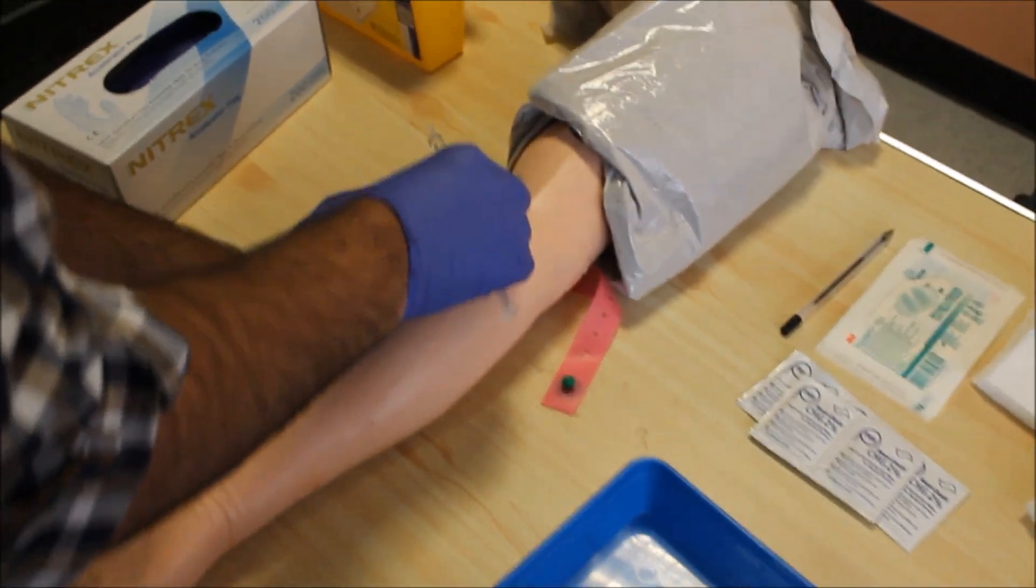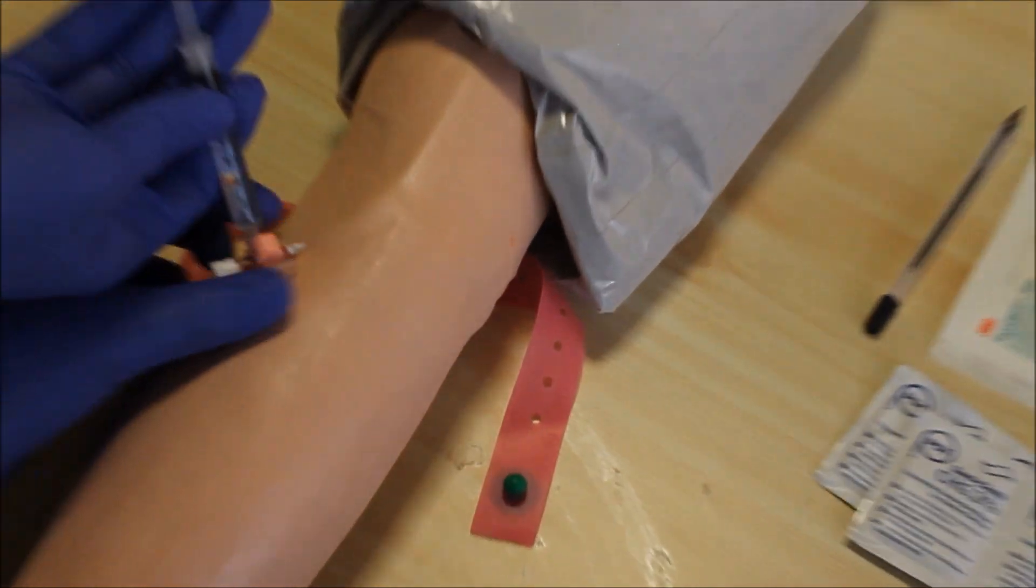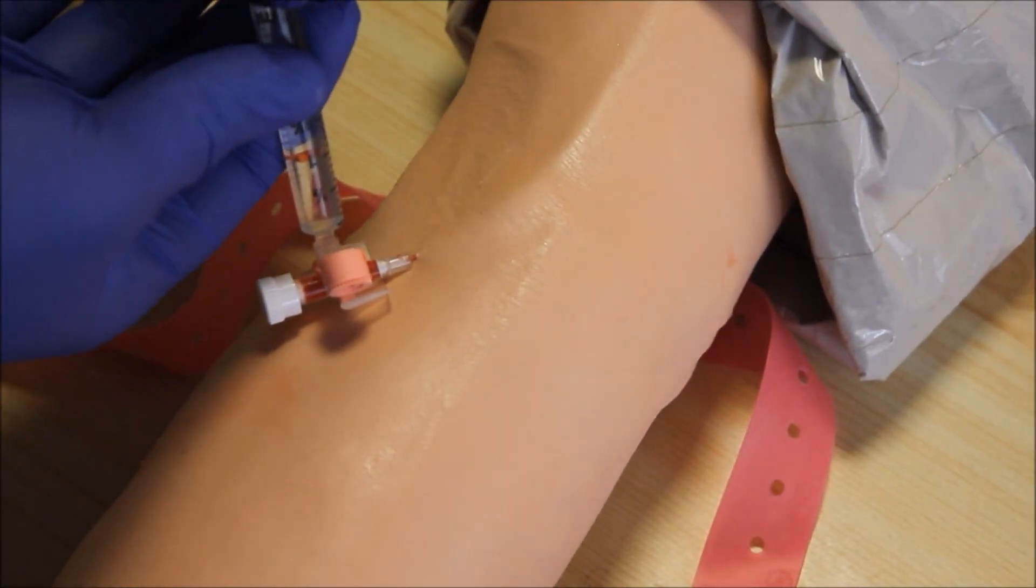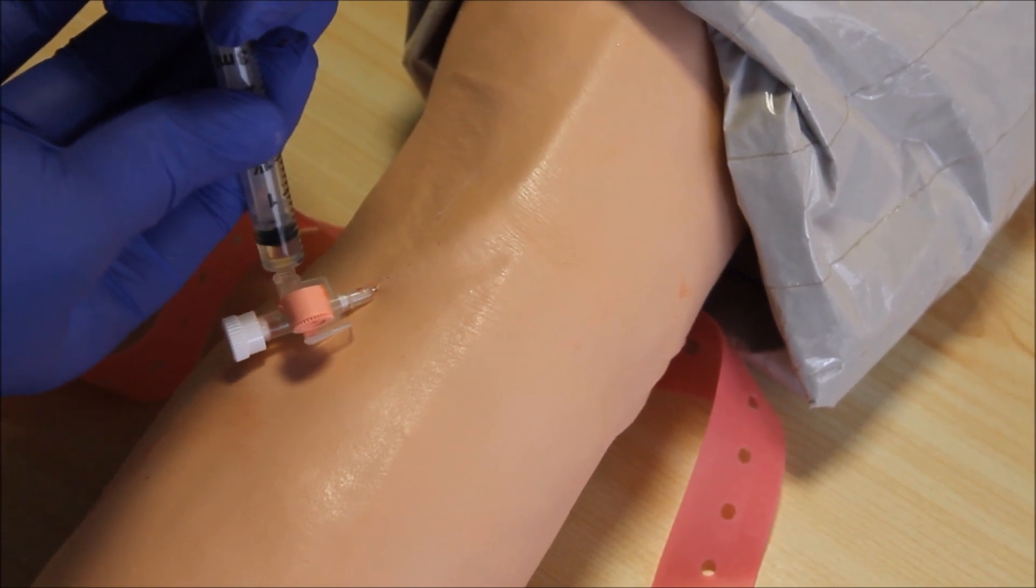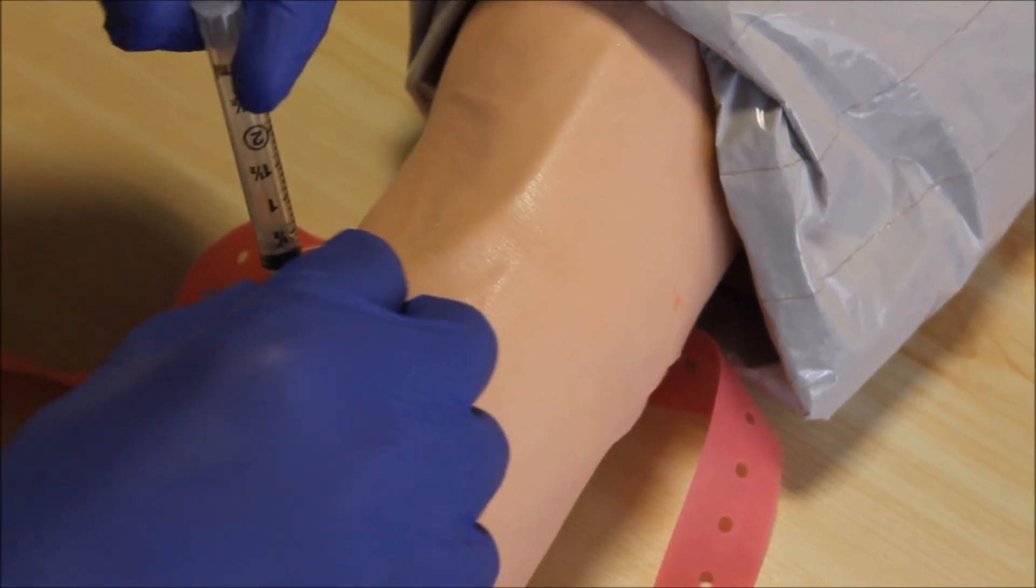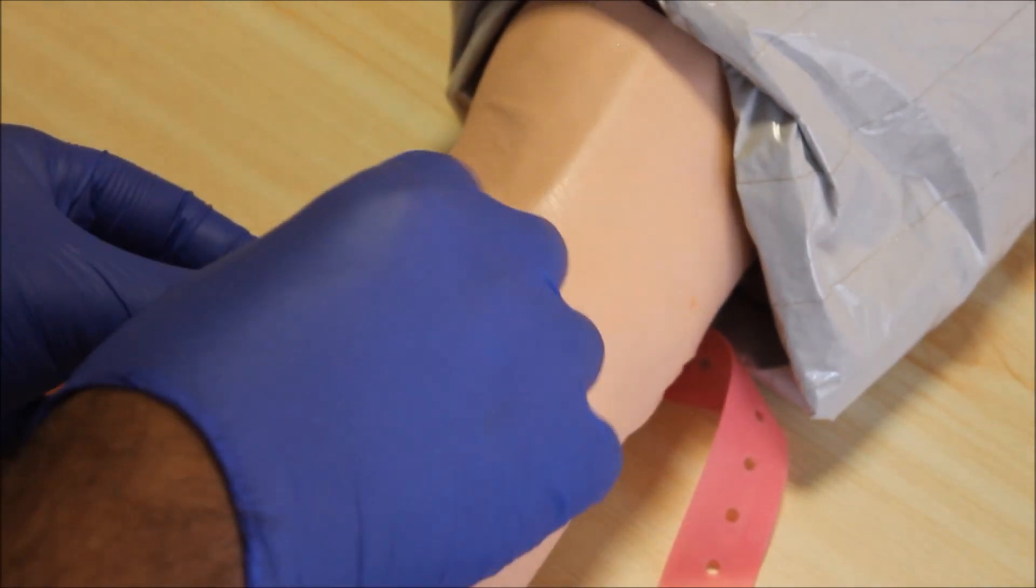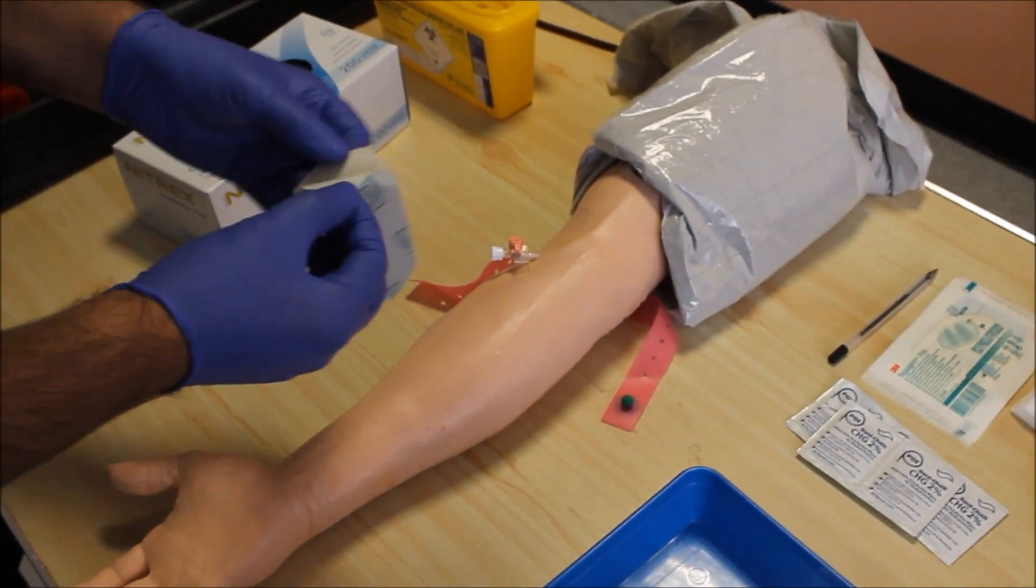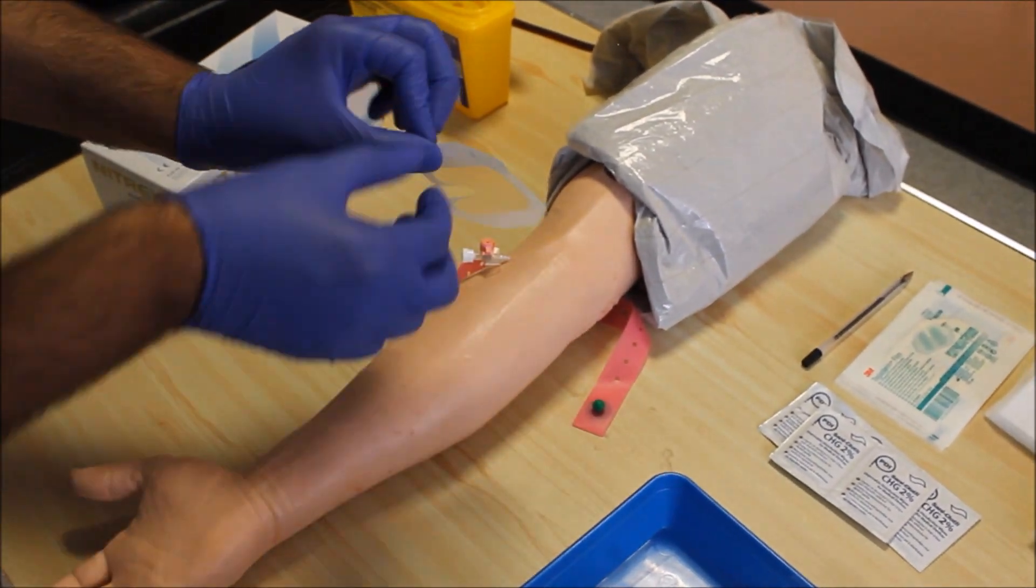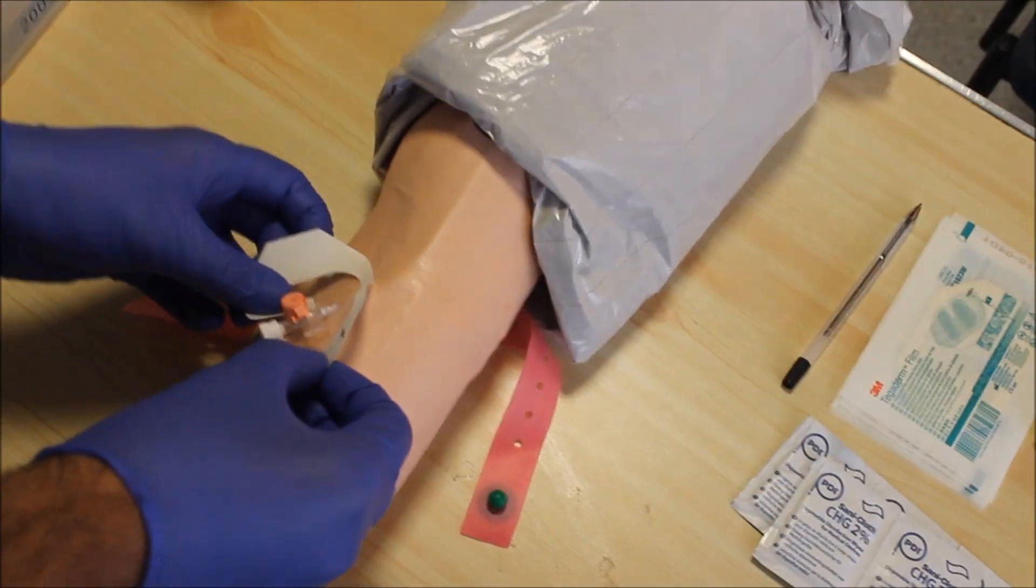Take the flush, open the top part of the cannula and flush the cannula. Place it on top of the cannula, and the last thing would be labeling the cannula.